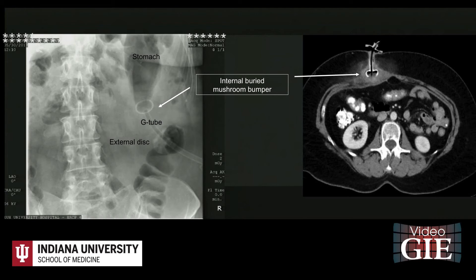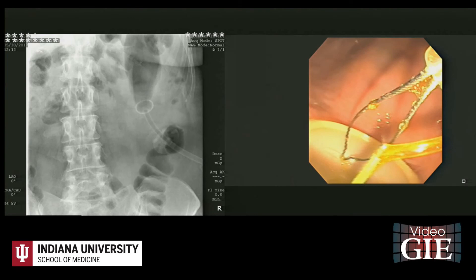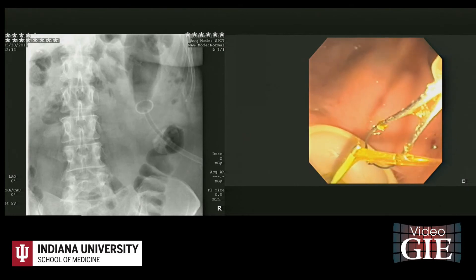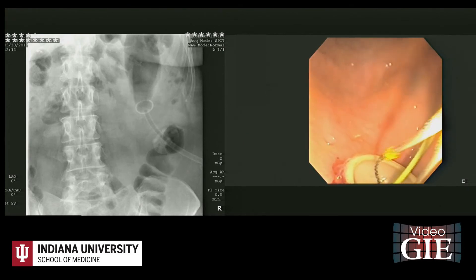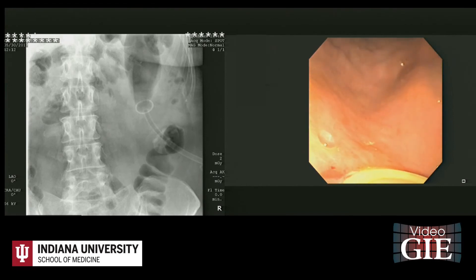The G-tube was then manually removed. The internal buried bumper was firmly pushed inward towards the stomach lumen. A wire was advanced through the existing gastrostomy, grasped with a snare, and pulled out of the mouth.